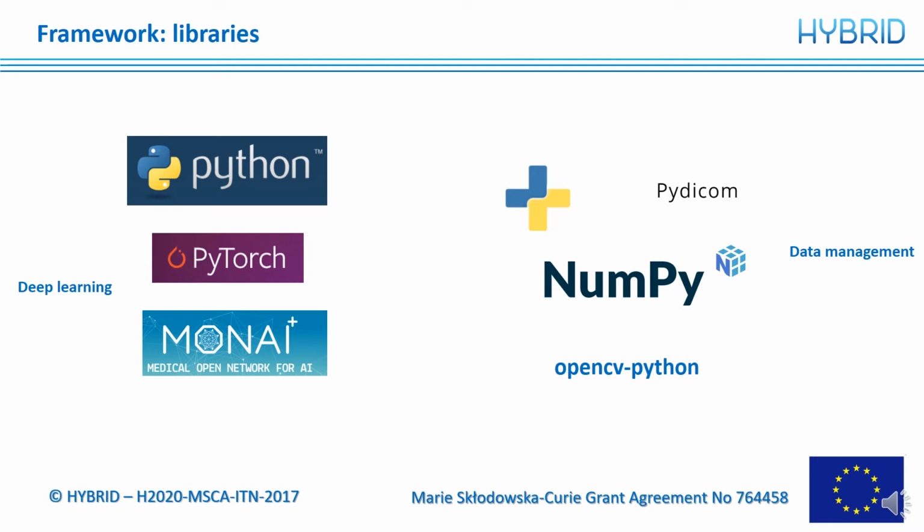I would like to suggest taking a look at the project MONAI, the Medical Open Network for Artificial Intelligence. This is an interesting platform that shares the different libraries, functions, and models that are useful for the different tasks that we need to apply in the medical image field.